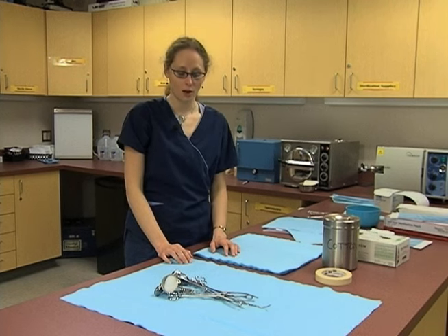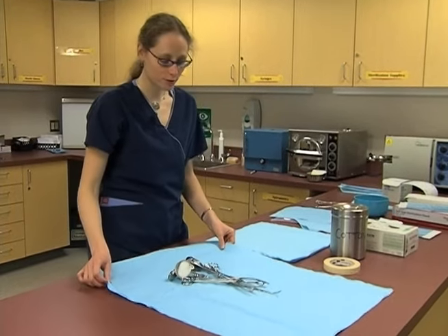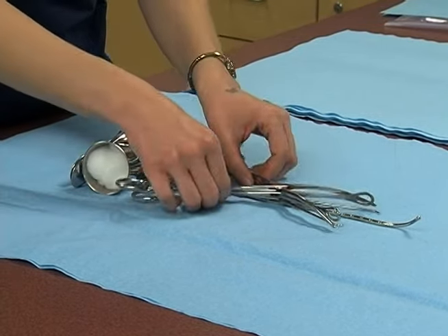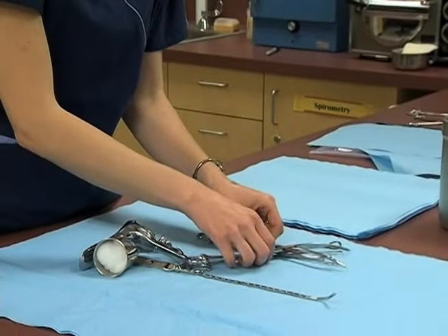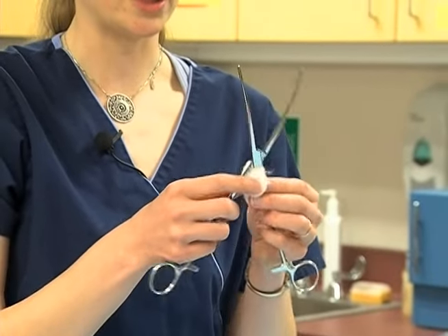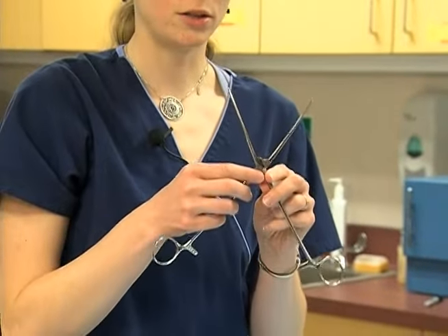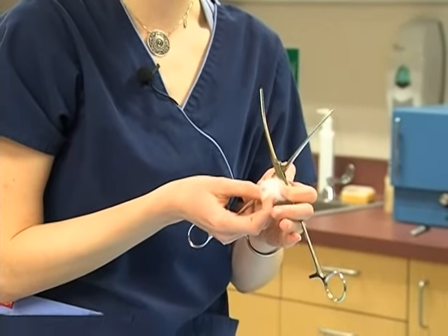Okay, so to get started with wrapping, this is a little bit more complex surgical set, but it's a nice demonstration of how to wrap a surgical set. For all of our tools that have hinges, we need to make sure that they're all open. The reason why we want to keep all these hinges open is because we want all the surfaces to be exposed to the incredibly hot air that will be created by the autoclave.